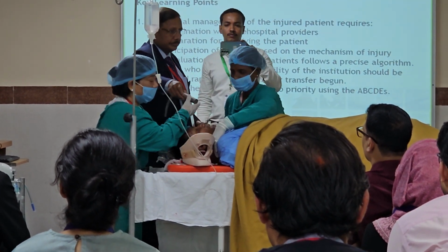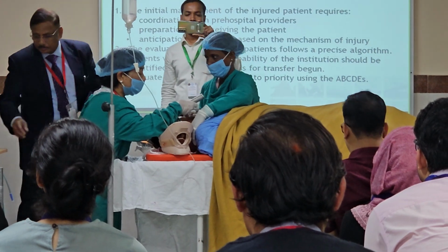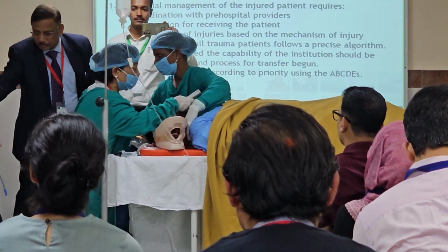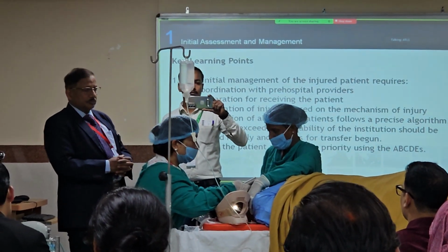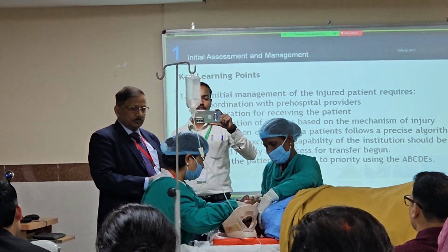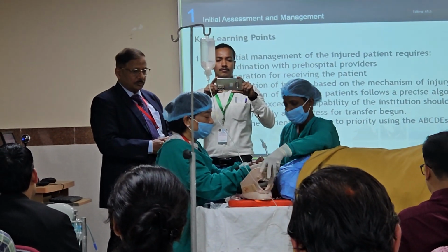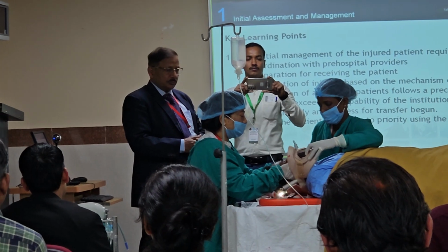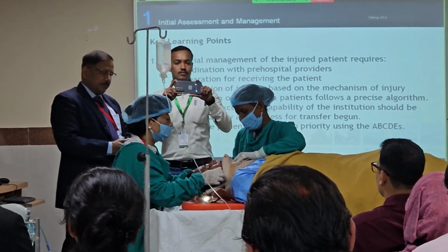Okay, right. And I am now going inside with the tube, and I'm through the tube, sir. And now I'm inflating the tube, and I've connected it to the air bag. Okay. Can you put the collar back on? I'm stabilizing the neck. Sir, can you tell me the saturation, please, now? Saturation is 88%.